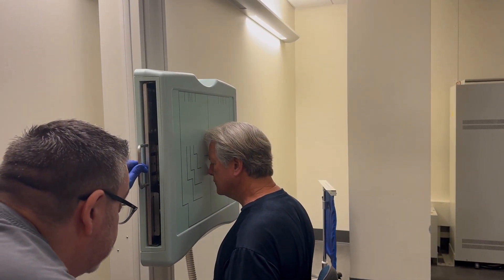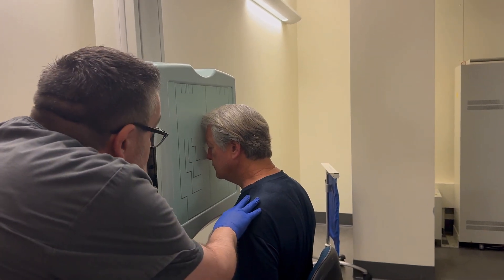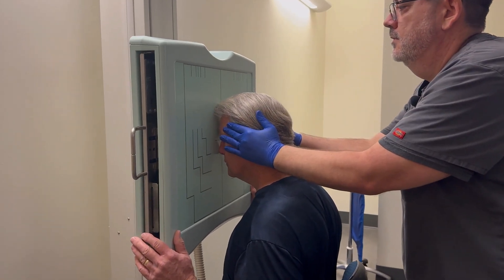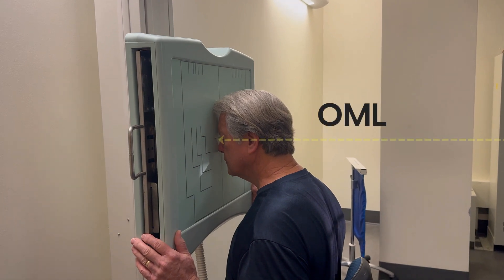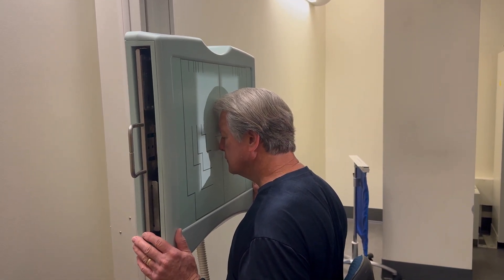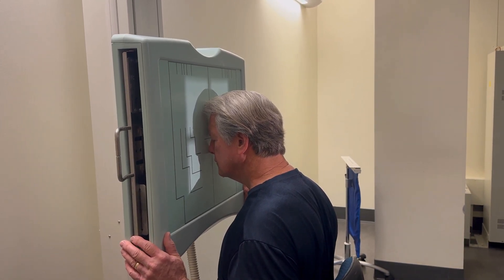Can you drop your chin just a little more? I'm going to lower the Bucky — right there. Got the nasion right in the center, no rotation. All you need to do once you're lined up is center your x-ray tube to the Bucky, which is already in alignment.